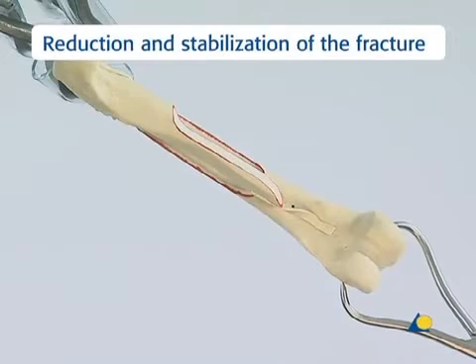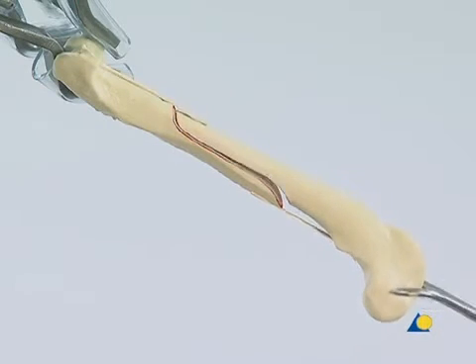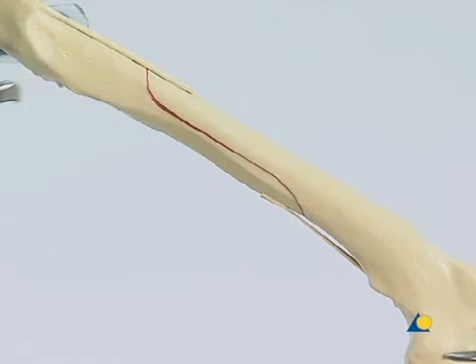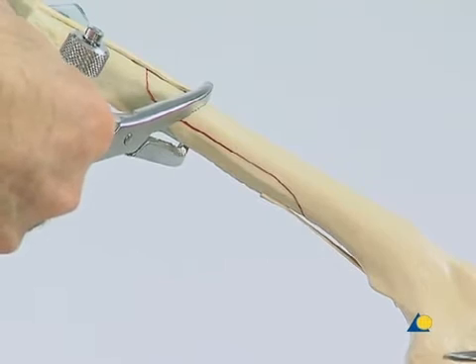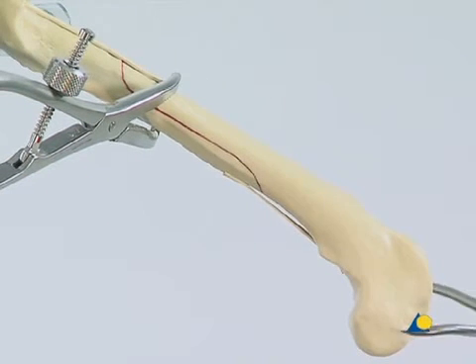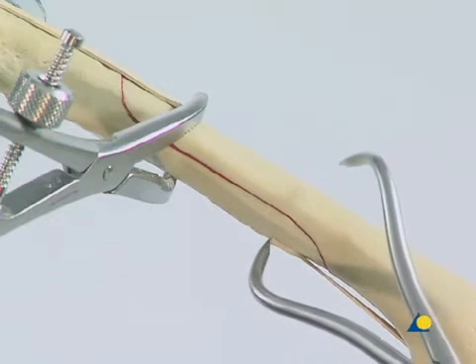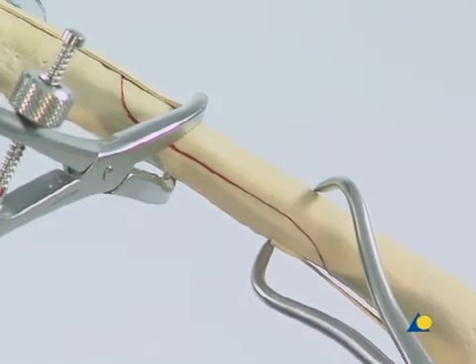To begin, the proximal end of the femur is secured in the vice. The pointed reduction forceps is applied to the distal end of the bone, and traction is used to reduce the fracture. The toothed reduction forceps is placed at the proximal end of the fracture. The pointed reduction forceps is then moved to the distal end of the fracture to secure the alignment of the fragments during application of the cerclage wires.